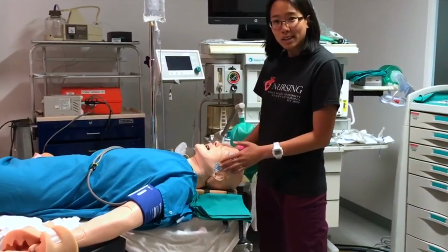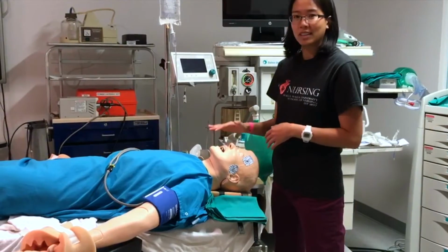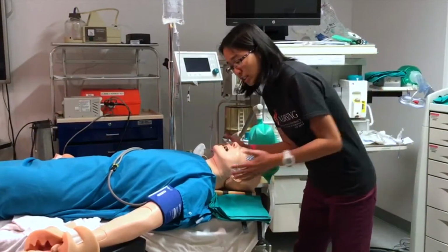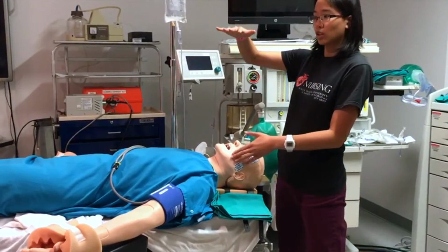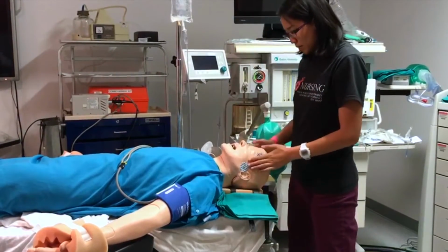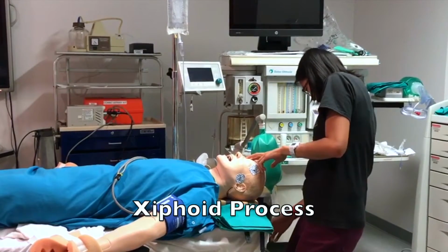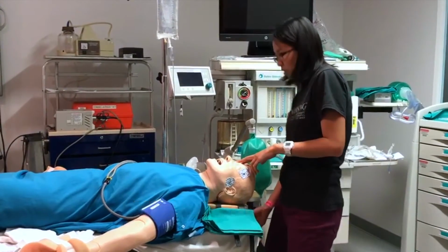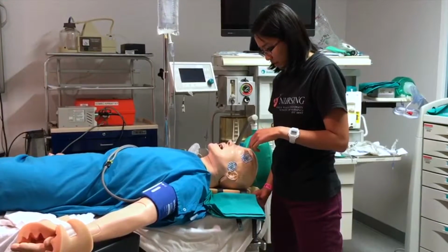I want to talk a little bit about positioning. It's important that the patient is positioned appropriately. That way you don't hurt your back when you're leaning too far forward and the patient's too short, or if the patient's too tall on the table, then you can't maneuver well when you intubate. So it's important that the mouth is kind of at your xiphoid process. So right now the patient's too low, so I'm just going to move him up.